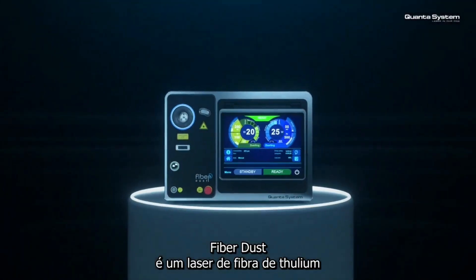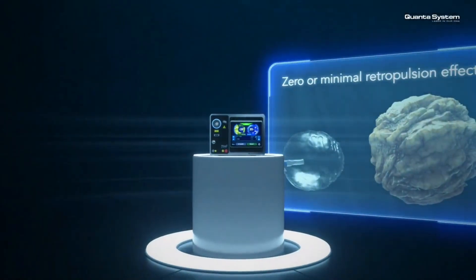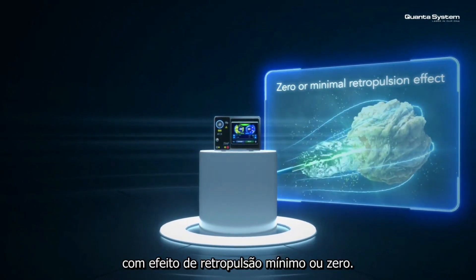Fiber Dust is a thulium fiber laser intended for lithotripsy and soft tissue applications. Its specific emission allows to dust the urinary stones with zero or minimal retropulsion effect.